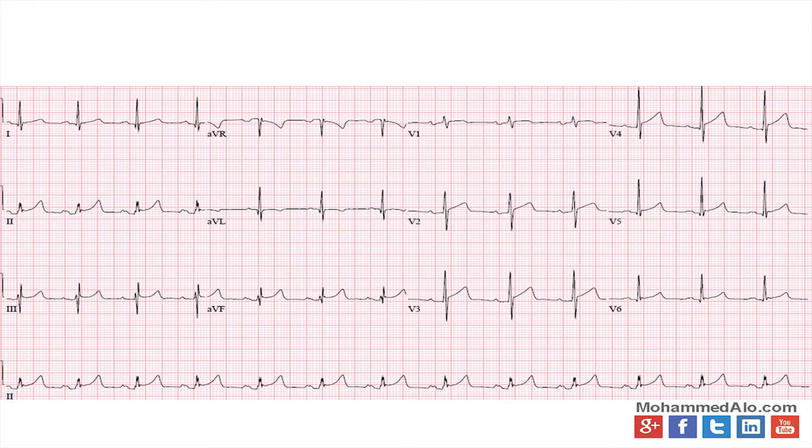When you have it depressed like that, it leads you to think they have stage 1 or 2 pericarditis. And pericarditis has multiple different stages on an EKG. It's really the first phase that causes those ST elevations and PR depression, so keep an eye on those.